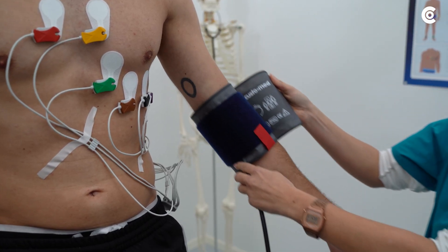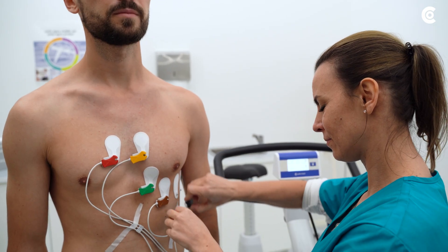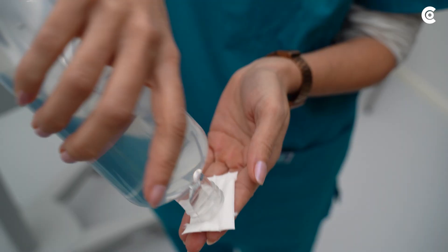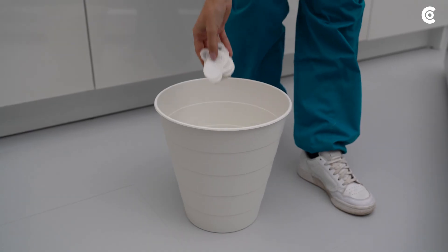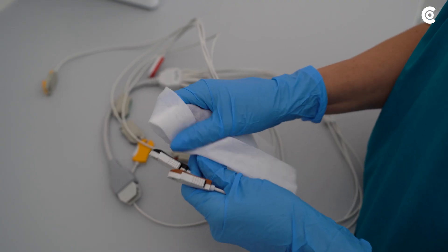As soon as the measurement is successfully terminated, first remove the clips from the patient and then remove the Cardio 300 and the electrodes. Dispose of the electrodes as well as the disposable bag and disinfect the clips and the Cardio 300.